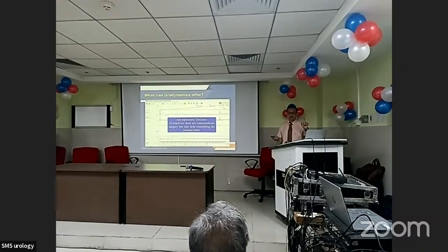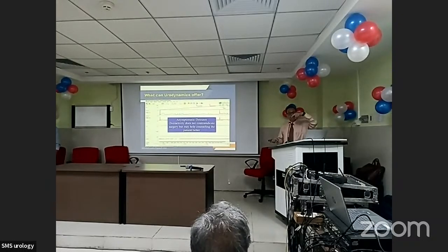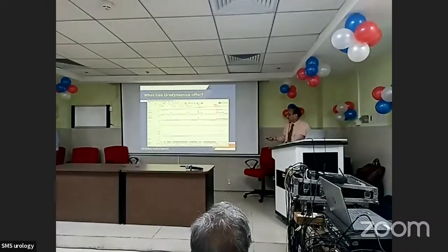But it's better to know and register that overactivity was present, because this woman, after surgery, may develop symptoms of overactivity, and she may blame you for giving her those symptoms by your operation. But now you have a defense. She had overactivity before surgery. You have not given her anything more. This is just a justification for doing urodynamics beforehand.